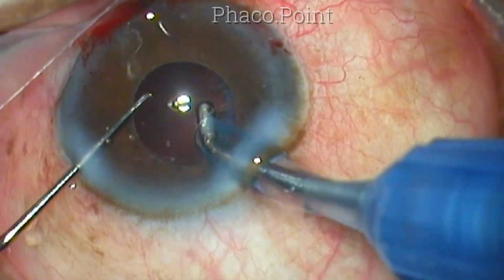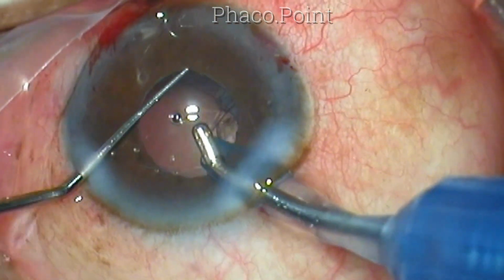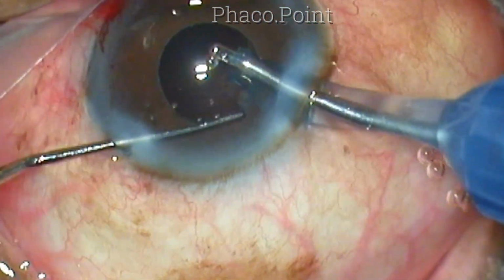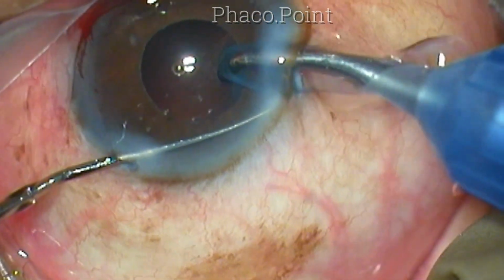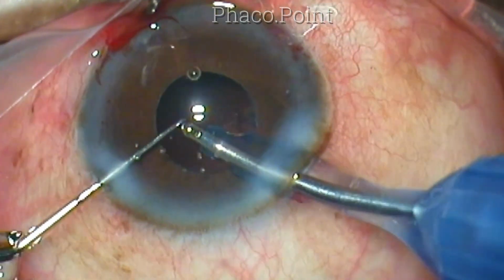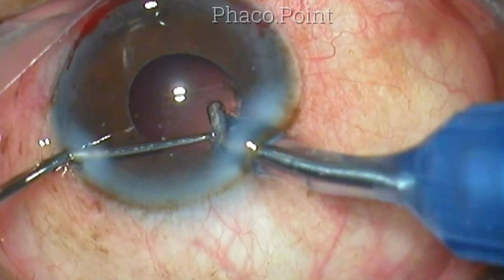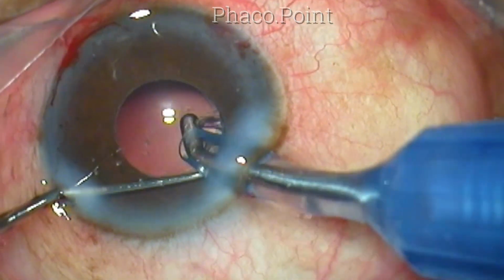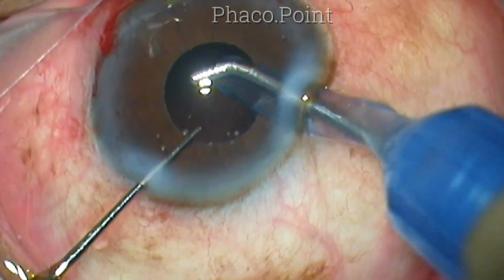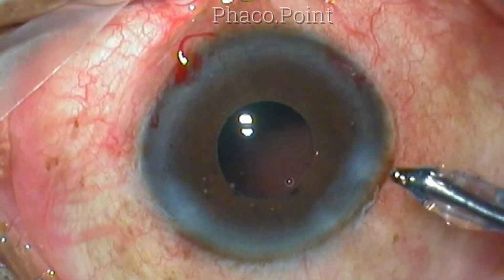So I am sure I have caught the anterior capsule, the inferior portion of the eye, and this could lead to a zonular dialysis, because in pseudoexfoliation cases the zonules are anyway weak. So I stay away from that 6 o'clock position, and I remove the cortex from all other portions of the eye. Pseudoexfoliation patients tend to have a higher degree of postoperative inflammation, and this can be made worse if you have retained cortex. Hence, make sure that cortical washout is done quite immaculately.